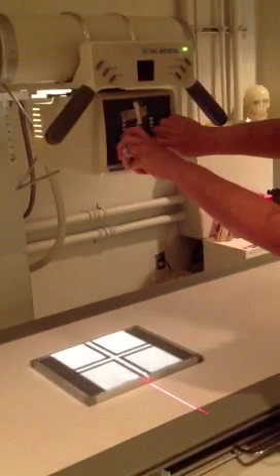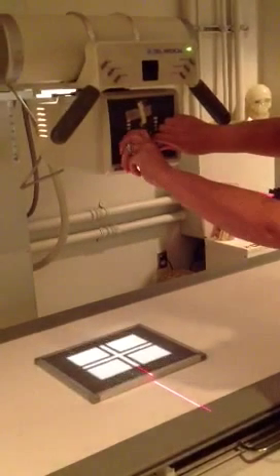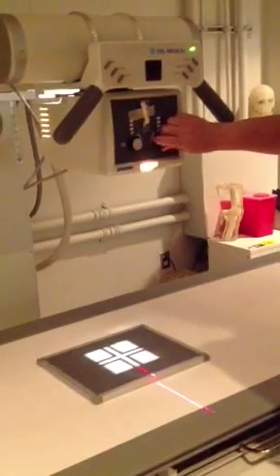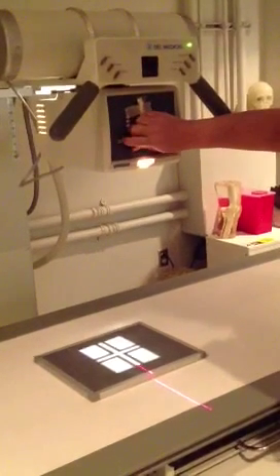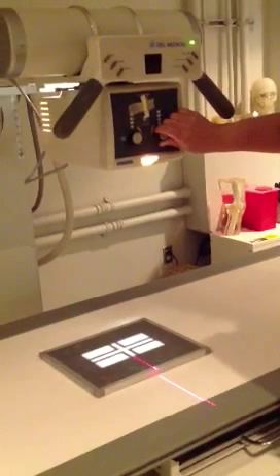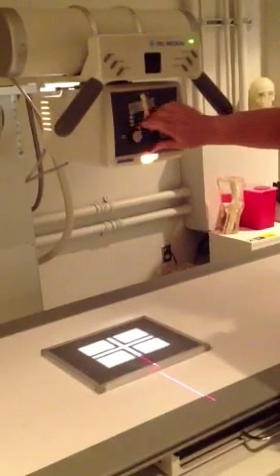This allows the technologist to control the size of the light, and basically that is the point of exposure for the patient.